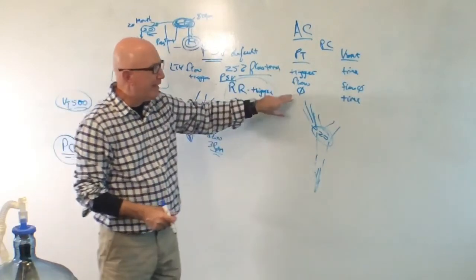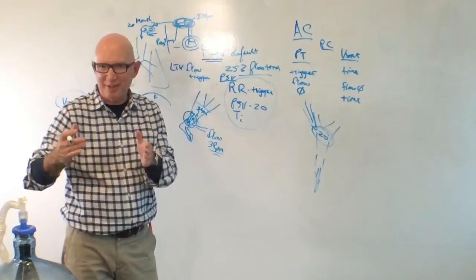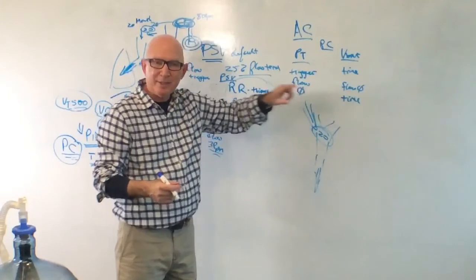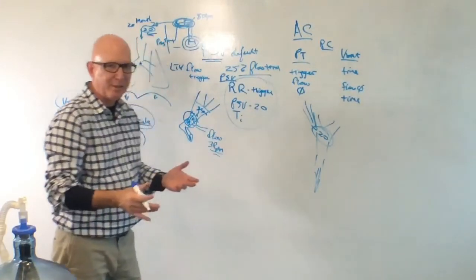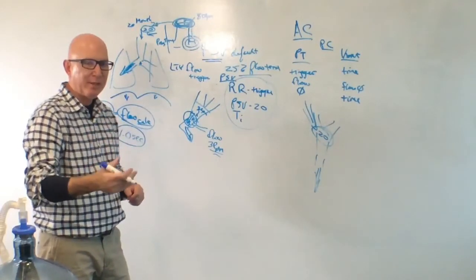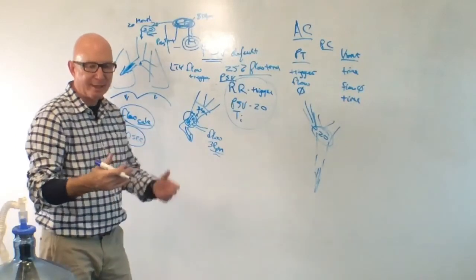And if they want to exhale after the I time is up, if they want to inhale longer than the I time that the ventilator is set for, the machine's not going to let them do that either. And you can see what can happen in this, because when you look at the asynchrony literature, it talks about a number of different things that can happen. So you can have a late trigger, you can have no trigger, you can have double triggering happening, and each one of those things is uncomfortable for the patient.